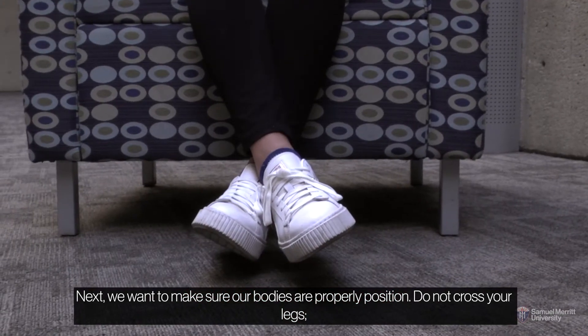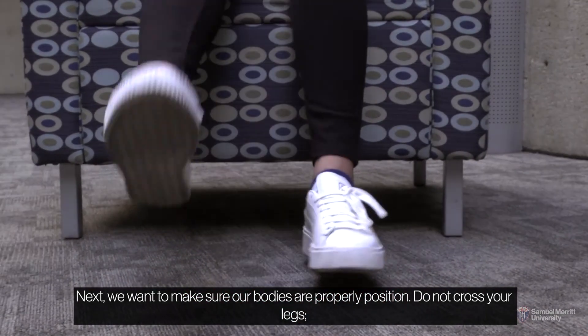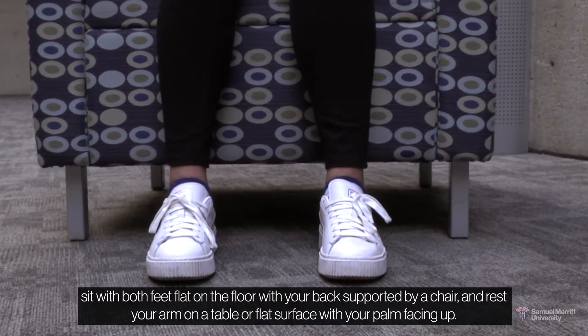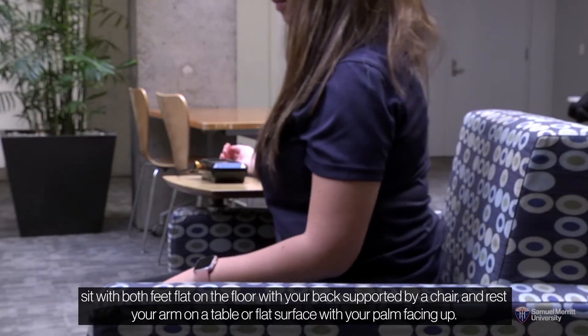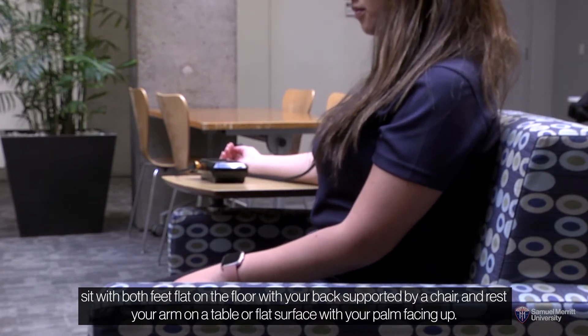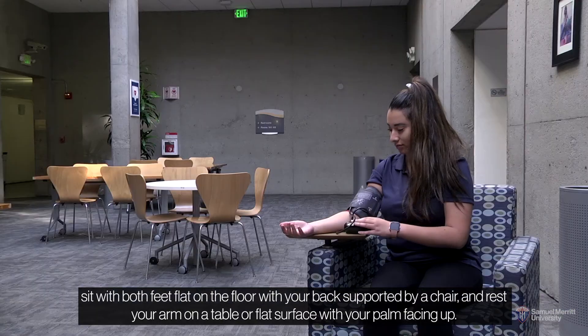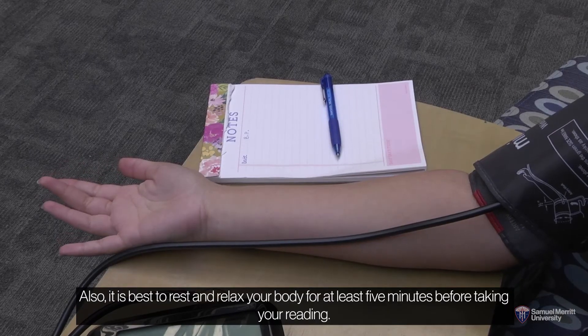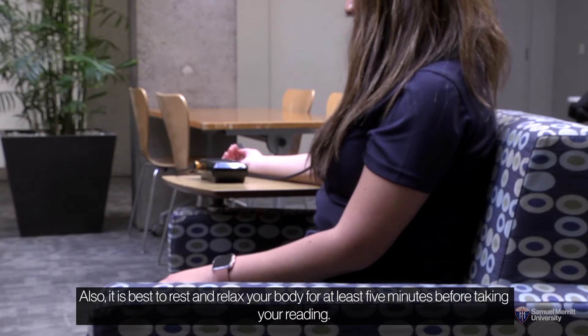Next, we want to make sure our bodies are properly positioned. Do not cross your legs. Sit with both feet flat on the floor with your back supported by a chair and rest your arm on a table or flat surface with your palm facing up. Also, it is best to rest and relax your body for at least five minutes before taking your reading.